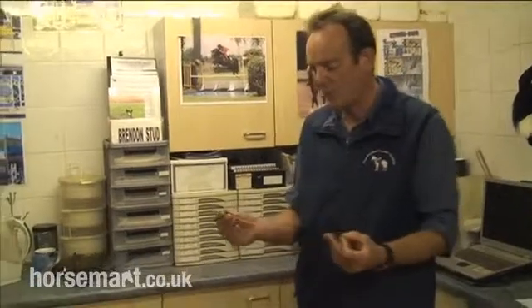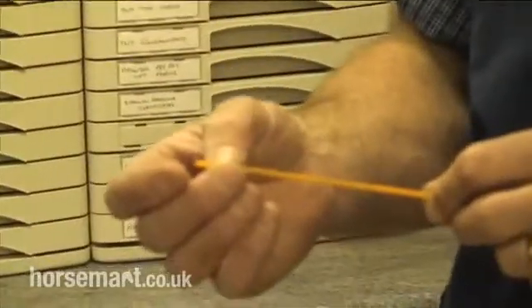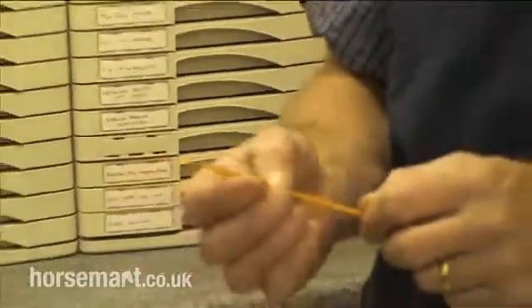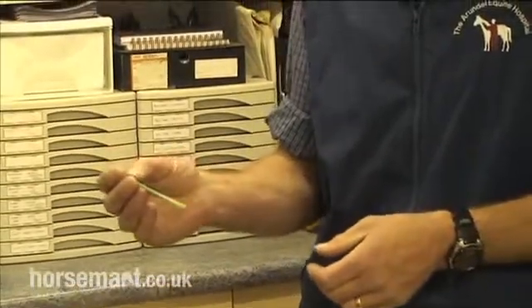An alternative to shipping chilled semen is to collect semen from stallions and freeze it in liquid nitrogen to minus 196 degrees C. It's frozen in very, very small straws — these are half mil straws. Each straw is labelled with the stallion's name, where the semen was collected, and what date it was collected. They're colour coded to different stallions with different colour straws.